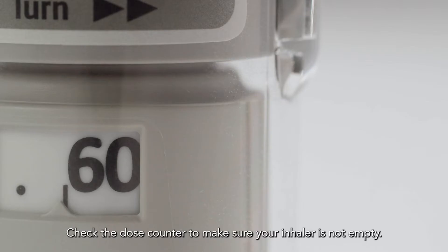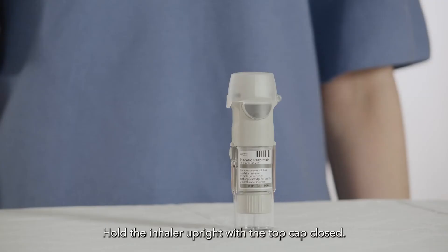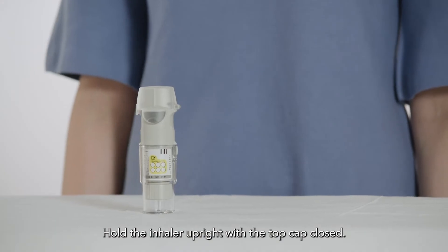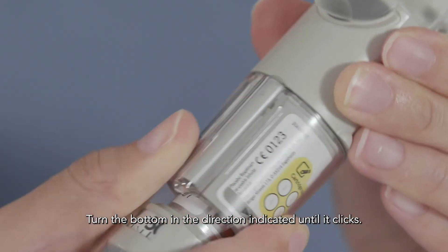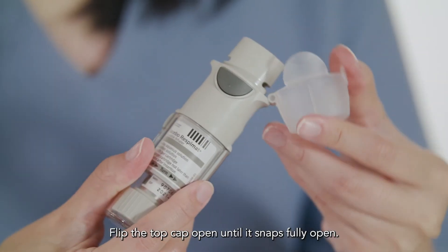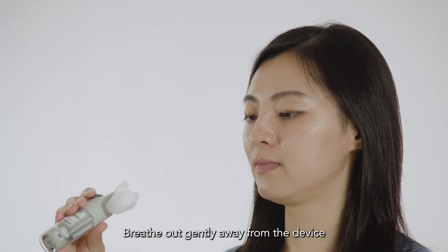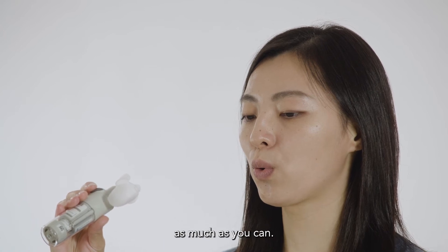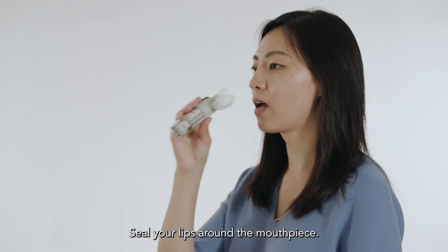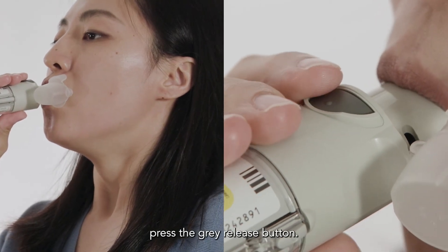Check the dose counter to make sure your inhaler is not empty. Hold the inhaler upright with the top cap closed. Turn the bottom in the direction indicated until it clicks. Flip the top cap open until it snaps fully open. Stand or sit up straight. Breathe out gently away from the device as much as you can. Seal your lips around the mouthpiece. Take care not to block the air vent. Start to breathe in slowly and at the same time, press the grey release button.